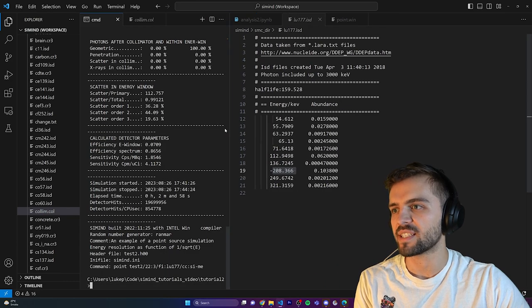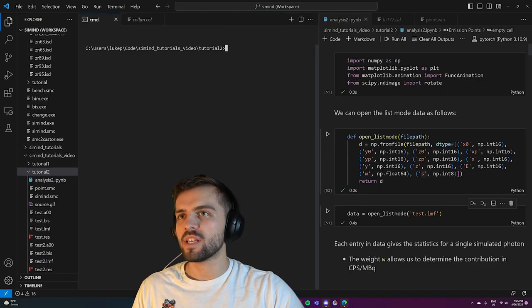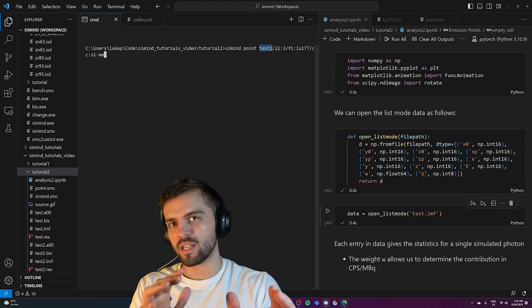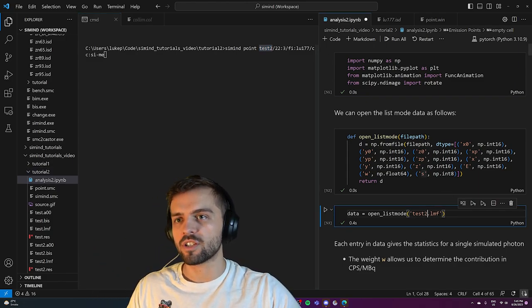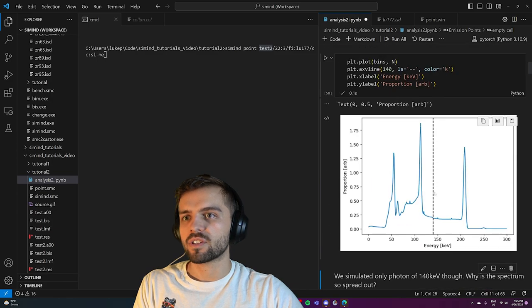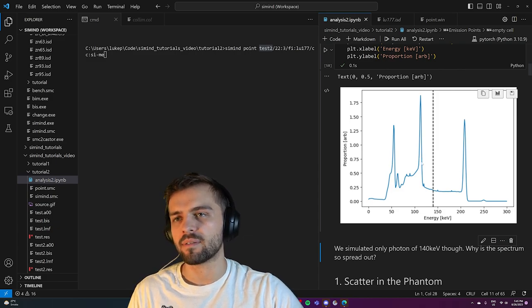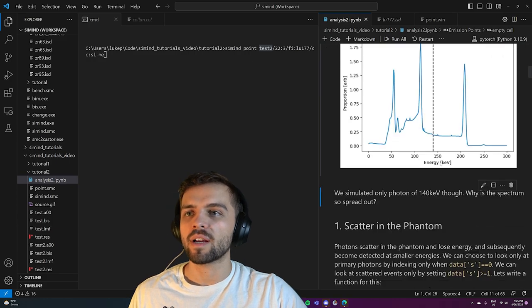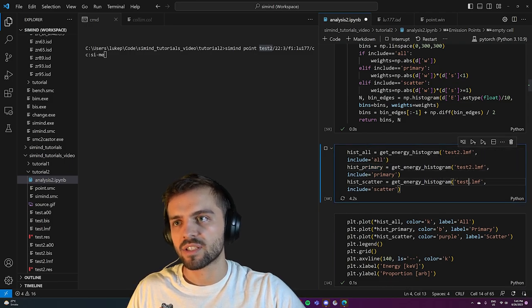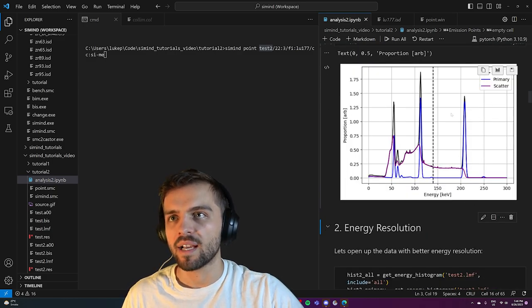We finished running our Lutetium-177 simulation. Going back to the analysis, looking at the energy spectrum now, it's totally different. I still have my line for 140 keV, but now I have the 208 keV peak I talked about and also one at about 112 keV. I can break the spectrum into scattered and primary like I did before, and sure enough you can see the primary spectrum and scattered spectrum as well.